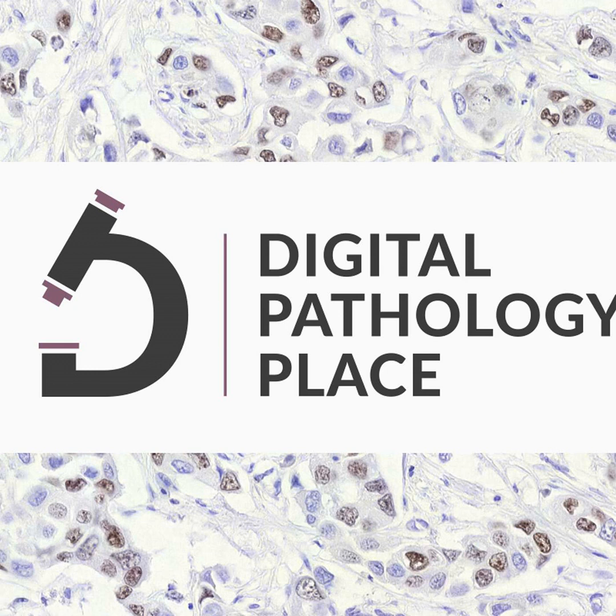It's done on tissue, and therefore we also face the classical histology challenges, be it tissue preparation artifacts or more mechanical artifacts like folds, bubbles, or also tissue morphology like necrosis. Of course, we have the whole chemistry, like antibodies that can have unspecific staining and so on. So that's, I would say, the common basis, independent of Brightfield or monoplex and high multiplex.